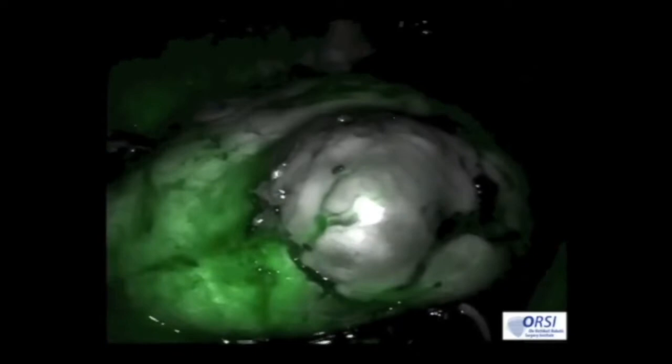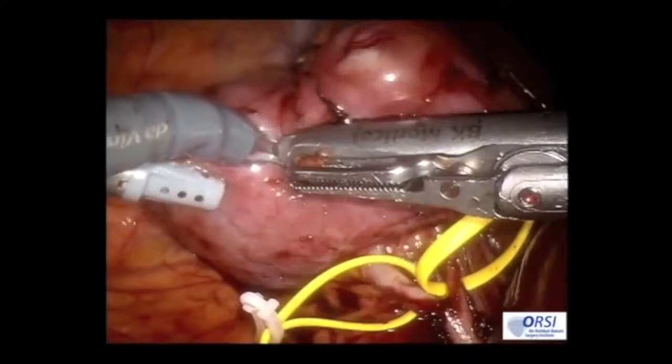Upon removal of the clamp, there is more perfusion to the inferior portion of the tumor and kidney. Ultrasound is then used to delineate the margin of resection.